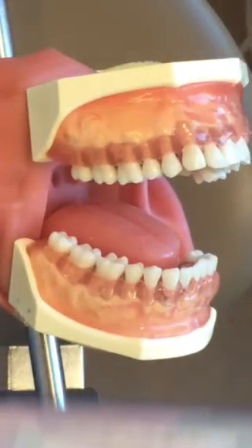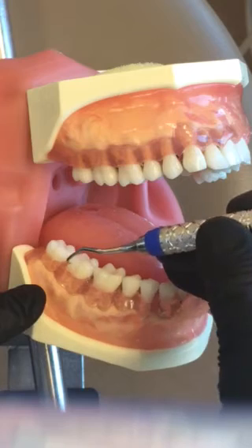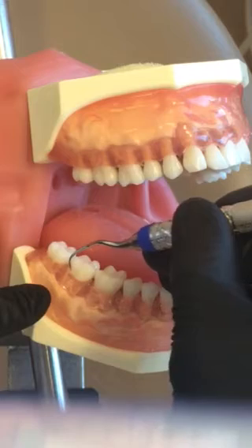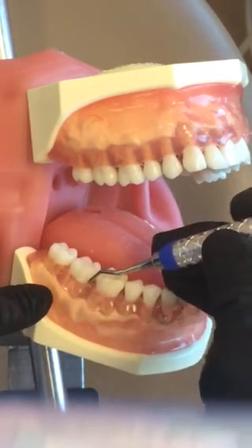Same thing on the mandibular — I would obviously adjust my patient — but just to demonstrate, I'm going to choose the correct working end, which is parallel. I'll start at the distal line angle, doing oblique strokes across the buccal and around to the mesial.